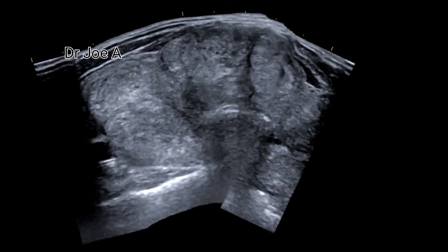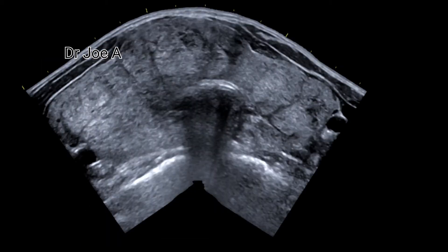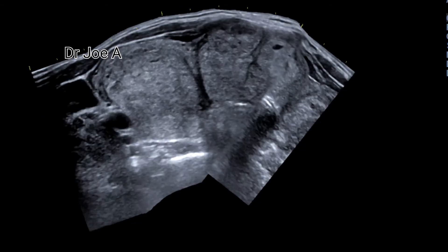A panoramic view of the thyroid shows the extent of the enlargement and also the number of large nodules within the thyroid.